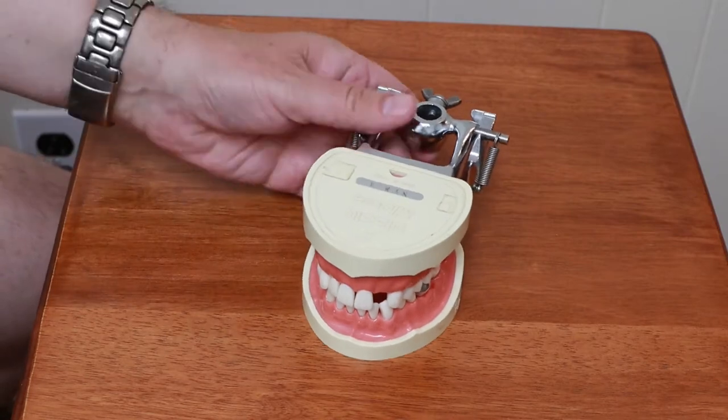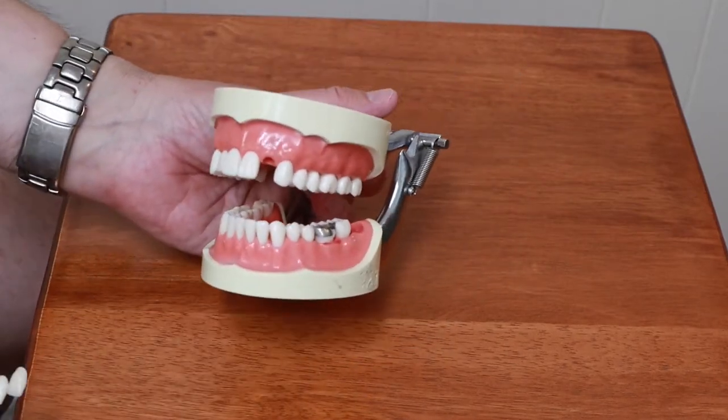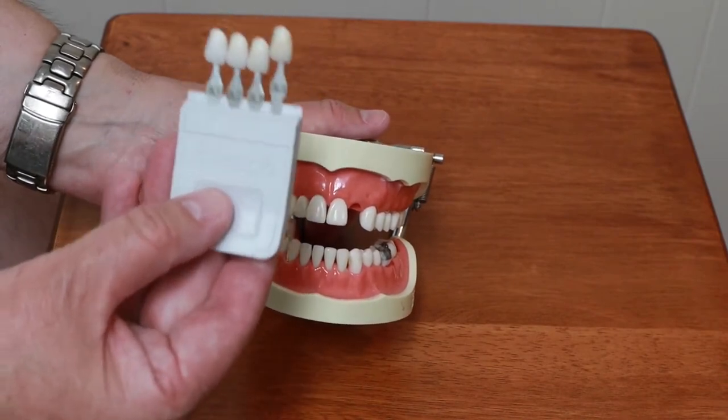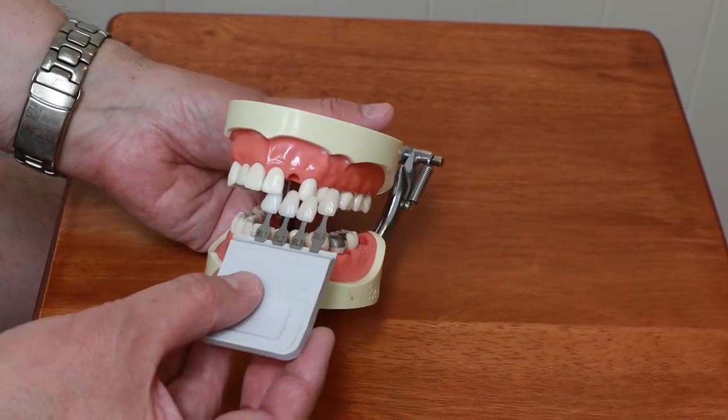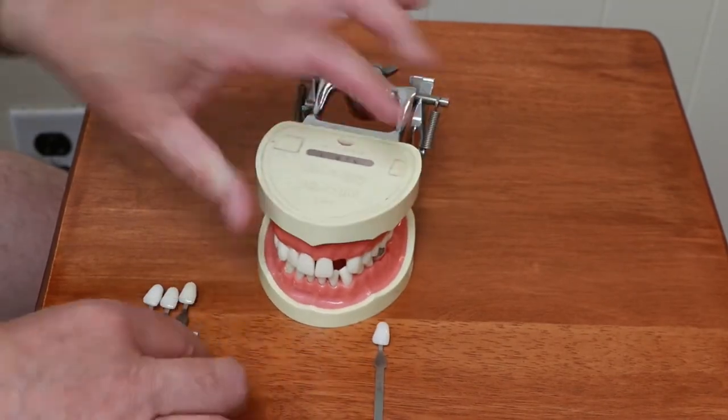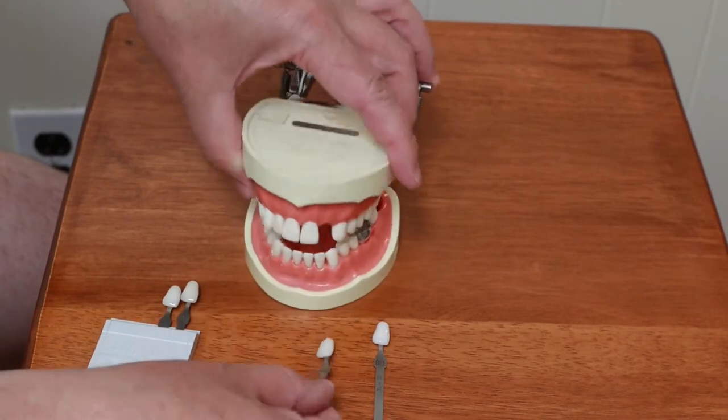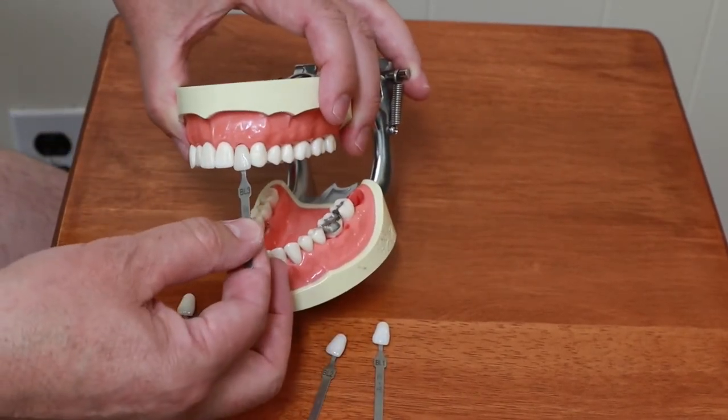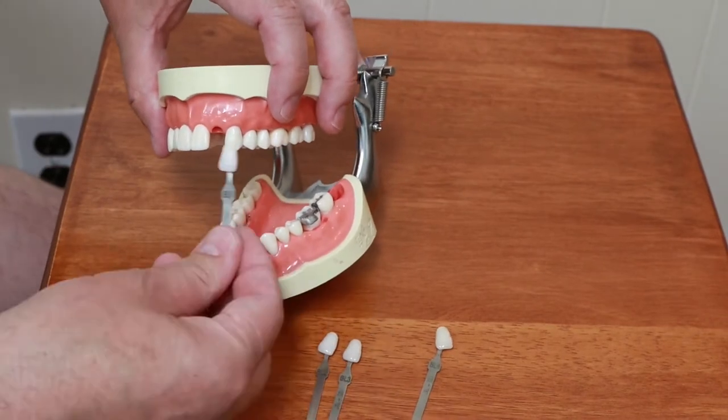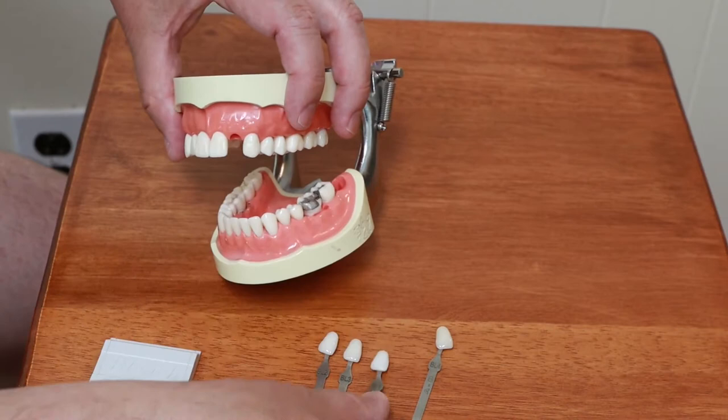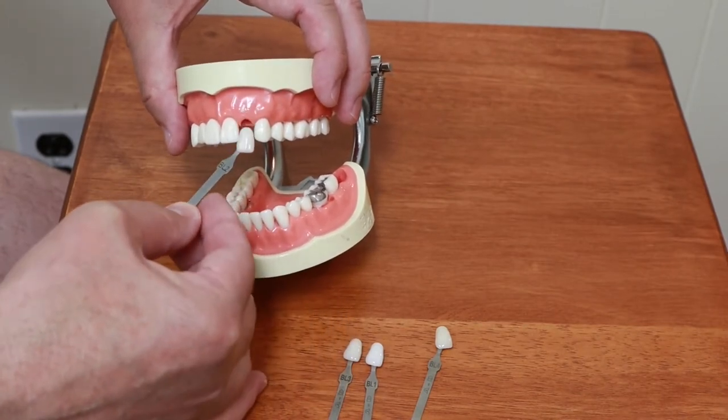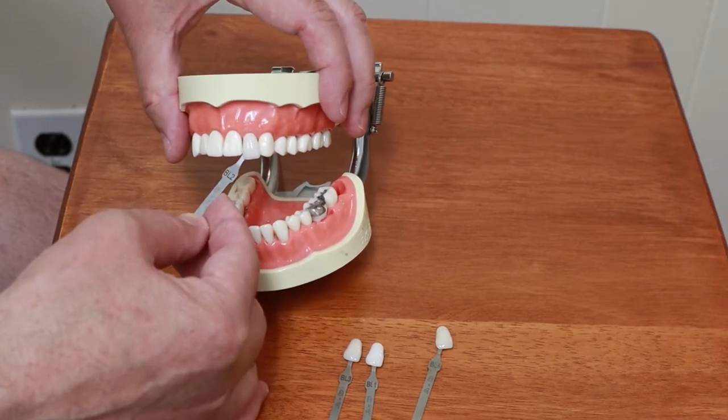Also take some photographs with the shade tabs next to the teeth. But since this is just Buster I'm not going to worry about that. Actually I changed my mind, I am going to take a shade for Buster. Checking my shade guide, actually the typodont teeth, the plastic teeth, they're pretty light colored so I'm going to need to use my bleach shade guide. These are really light. And of the four, we got the brightest. That might be a little too light. Let's see number two, that's a little bit better. Which color do you like? I think I'm going to go with number two. Not an exact match but it's for a typodont, it's for a model, it's for YouTube.